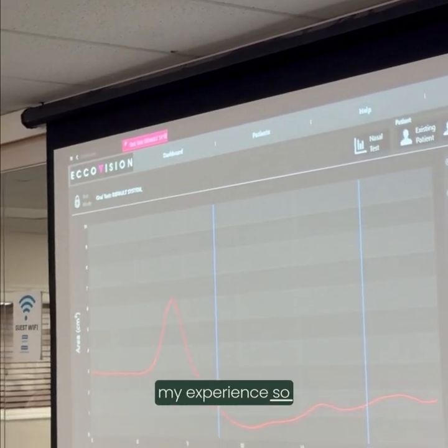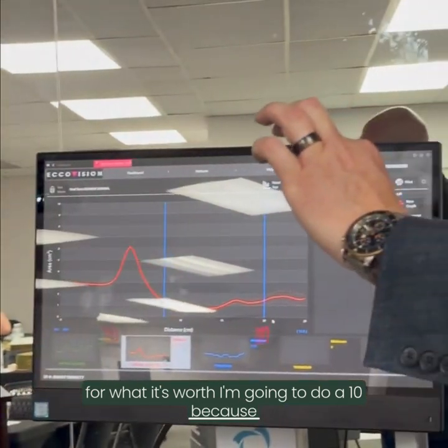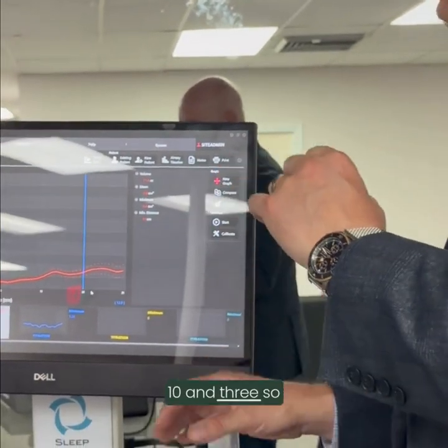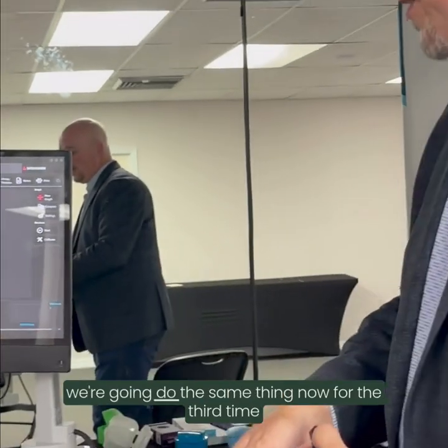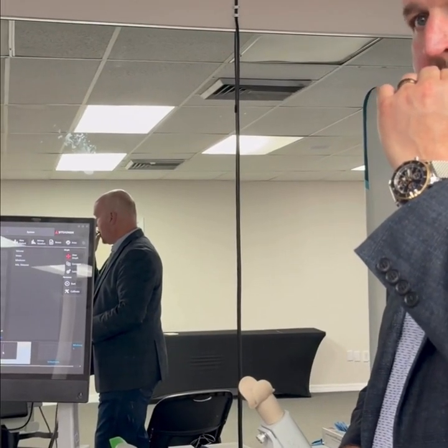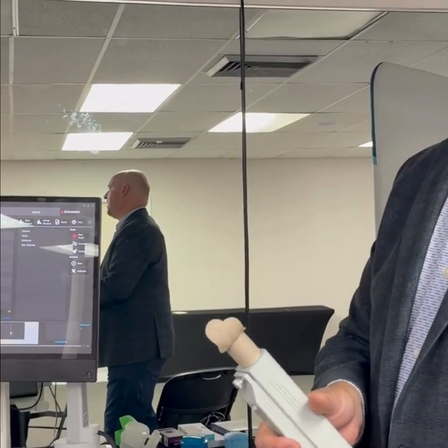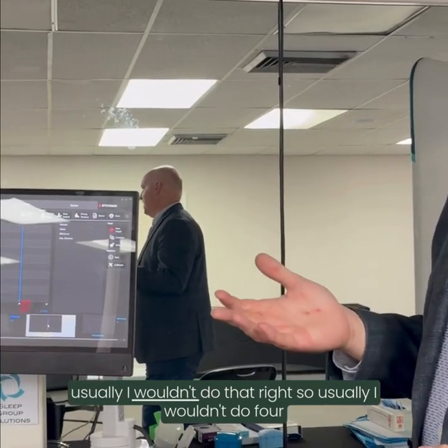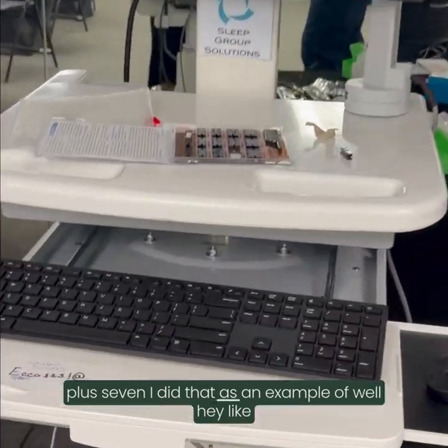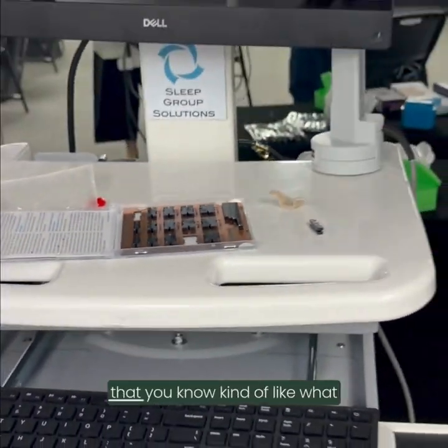In my experience. So, for what it's worth, I'm going to do a 10, because that's what my appliance is set at. 10 and 3. So we're going to do the same thing now for the third time. As a general rule, you went as low and as protrusive for the first one. Usually I wouldn't do 4 plus 7. I did that as an example of, let's just go as far forward as we can.